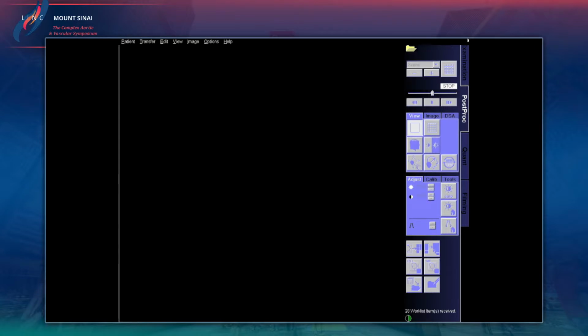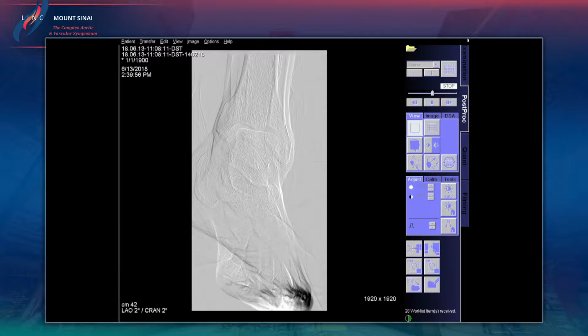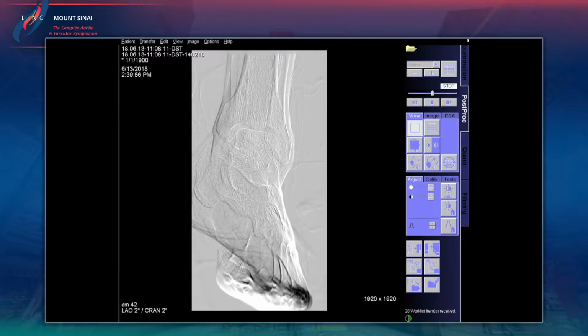Let me just take a picture now. We've got the EKG lead out of the way. Again, he's uncomfortable. Let's see here. Sir, try not to move.